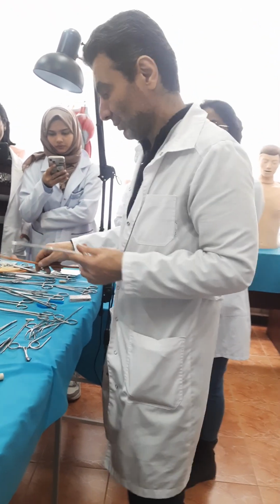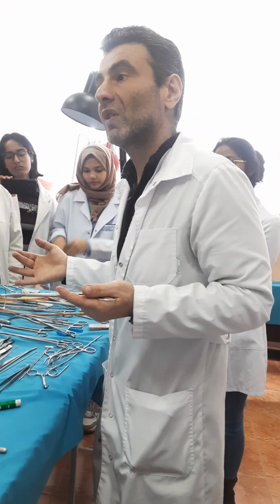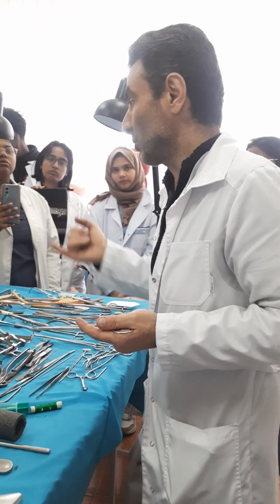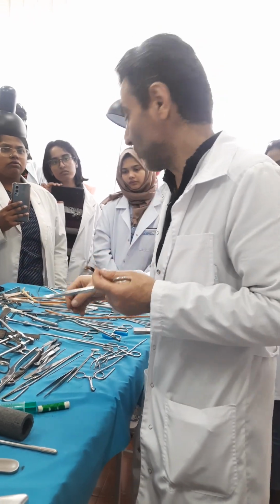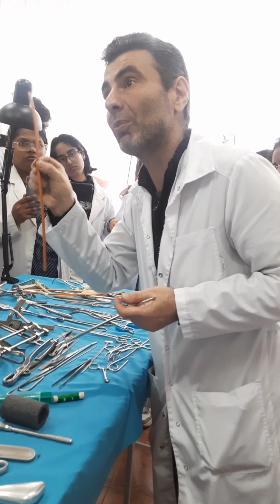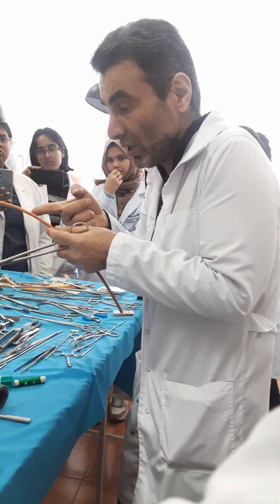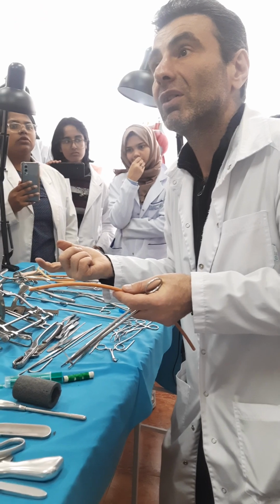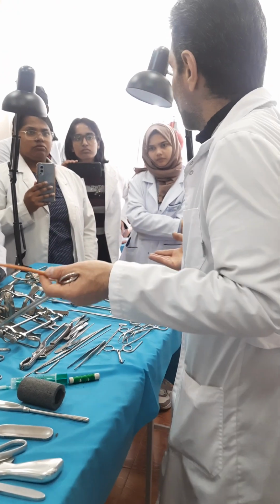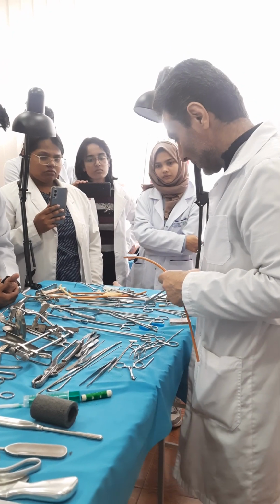It's understandable. And the last classification, needles, we can divide into sharp pointed and blunt pointed. Blunt pointed, usually, we use to suture parenchymal organs, like the liver. Even with your finger, you can perforate it, but inside of it we have tubes, which do not need to be perforated, for example, our bile system. If I use blunt pointed, it will touch it and press it, and will not perforate it. If I use sharp pointed, I perforate it, the bile will come outside, and that will make a problem. Yeah, possible complications, of course.